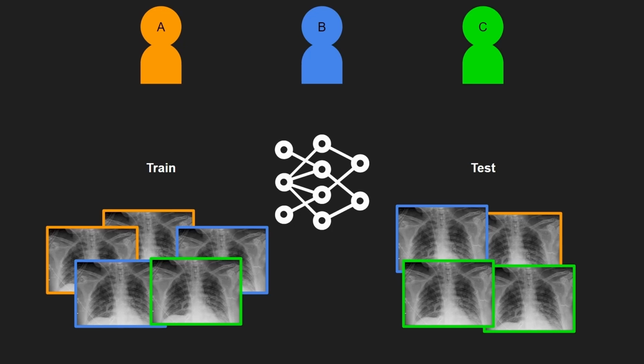While this approach is simple, it presents a major issue for the model. Since multiple scans for the same patient look very similar, having the same patient scans in both the train and test sets results in the model memorizing how the patient looks instead of recognizing meaningful features about their lungs. How do we fix this issue?